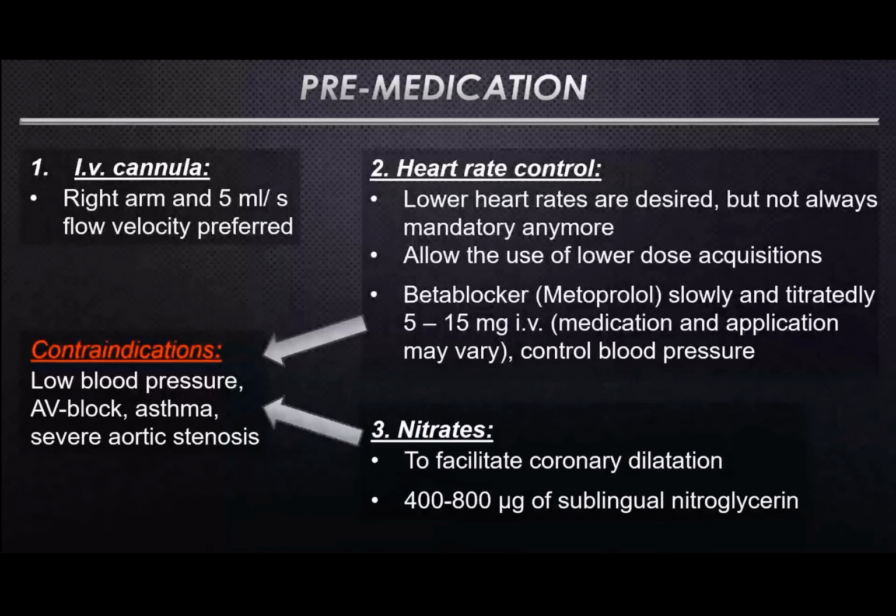Nitrates are also very important to facilitate a coronary dilatation. It's supposed to avoid coronary spasms that can rarely occur during acquisition, so you want to avoid that and apply this mainly sublingually, but there are also patches available for the patient's skin.